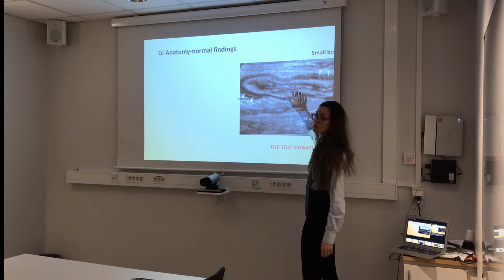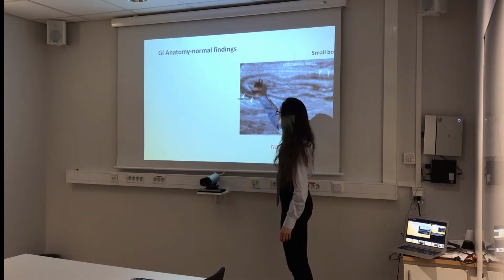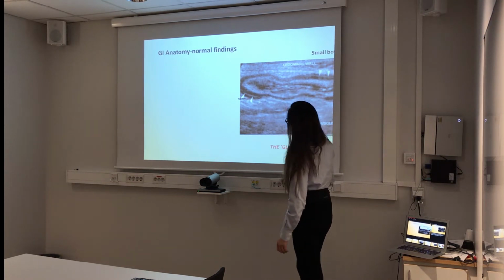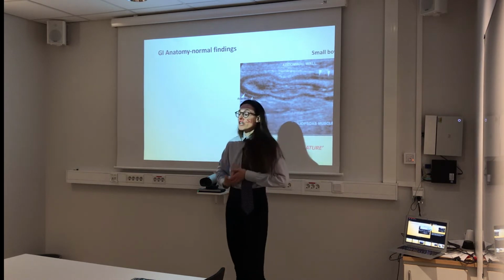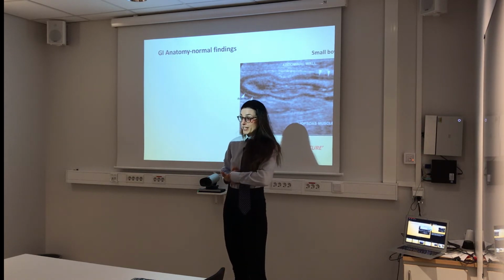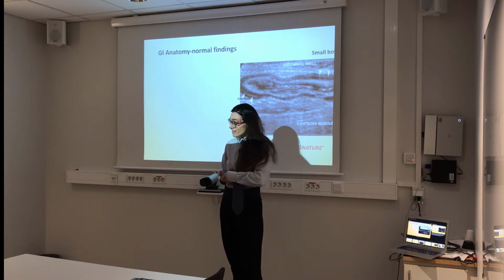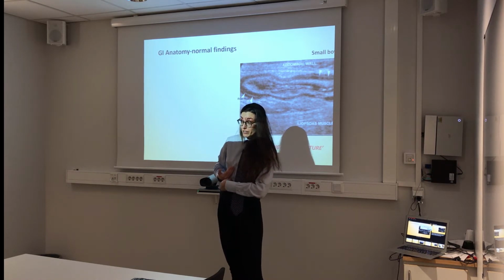If we are talking about small bowel, this is absolutely normal. So we can visualize from the outer to the inner side until the mucosa, okay? Remember, every time I'm in the department, I say, what you see close to the liver is the stomach. The stomach is looking like small bowel. It's another structure in your gut that you can visualize. And it's sitting normally very, very high, close to the liver corner and close to the gallbladder, right?